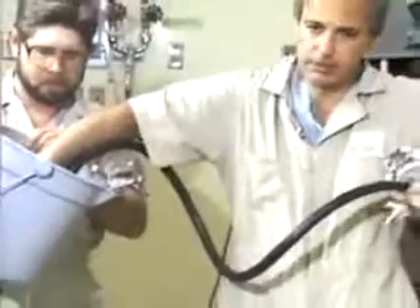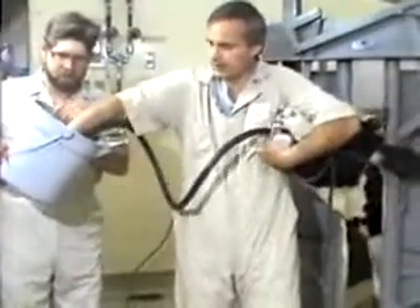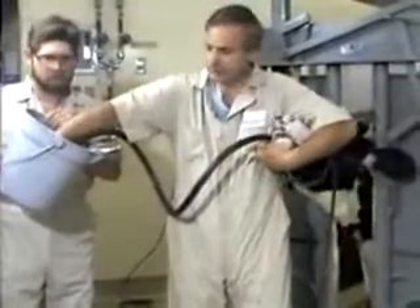The third way that fluids can be delivered is to let the tube get completely filled, then plunge it down into the bucket, elevate the bucket, and siphon it. If you elevate the bucket above the level of the animal and the tube has been full of water, it will siphon a whole bucket of water down into the rumen.